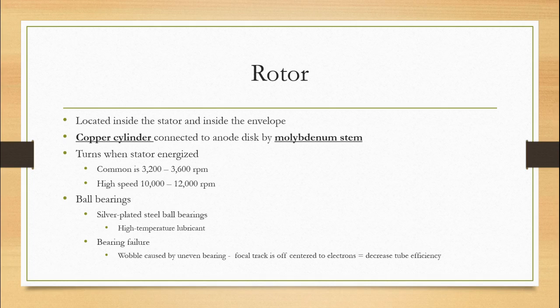All right, so what's making that sound is these ball bearings. They're silver-plated steel ball bearings. They melt a little bit when the magnetic induction happens with turning of the rotor, and they provide a natural lubricant for those steel bearings with that silver. When the bearings fail, they start to warp a little bit. As you can imagine, them getting hot and cold constantly with the silver lubricating, this can cause failure.